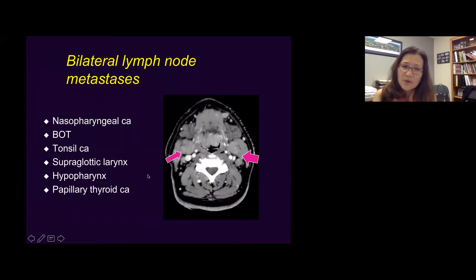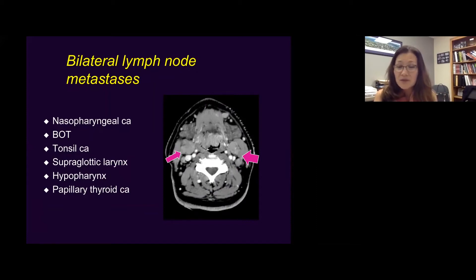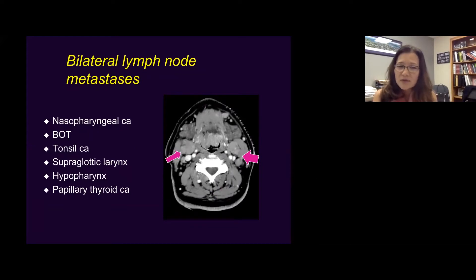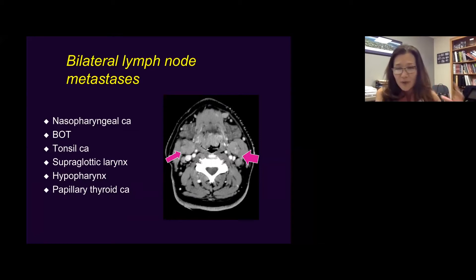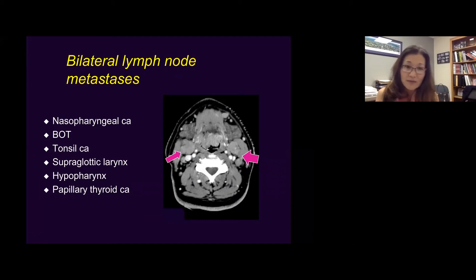A few notes about bilateral cervical lymph node metastasis — what kinds of cancer give you bilateral disease? They are nasopharyngeal cancer, base of tongue cancer, tonsil carcinoma, supraglottic laryngeal cancer, hypopharyngeal cancer, and papillary thyroid cancer. These cancers, even when the primary is on one side, have rich lymphatic drainage pathways to the bilateral neck. So don't just look at the side where the cancer is — you must always look at the contralateral side as well.